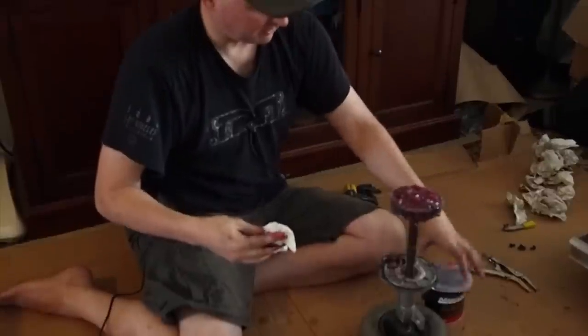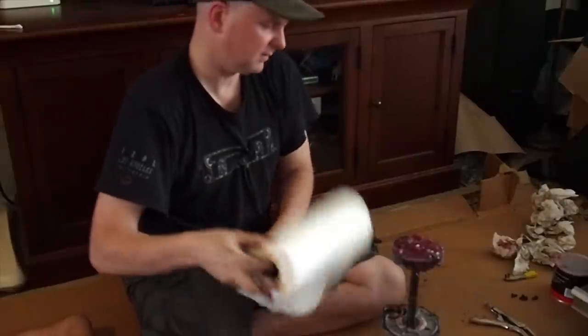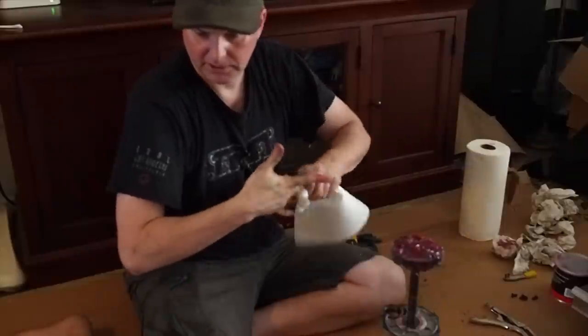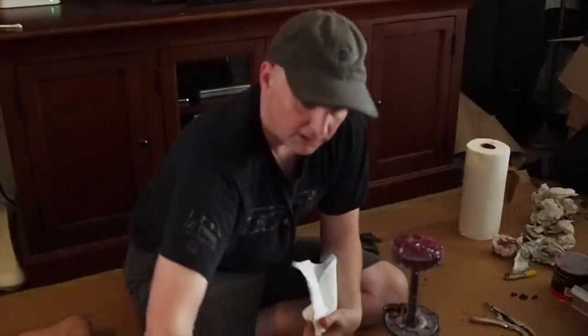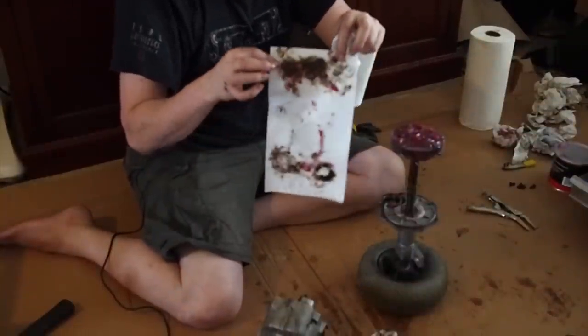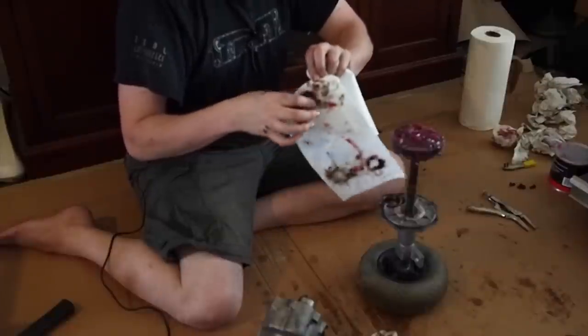It already had a bit of grease. I was just adding back to it. I didn't clean it off completely because it wasn't really dirty. I've been putting it on the paper towels. But you could see, I cleaned it off last time. You could see just from the month of using it, this has turned pretty brown. So that brown is probably mixed metals.